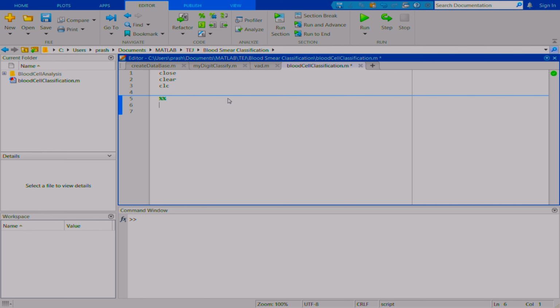The data is located in a particular folder, and inside the folder we have many subfolders. So I have to specify the complete data path. I'll define a variable, which is the path of the data set. So the data set path is equal to, if you remember, you can define that. Let me go through this. Let me open this.